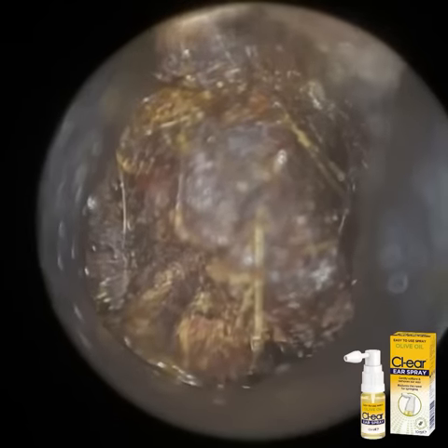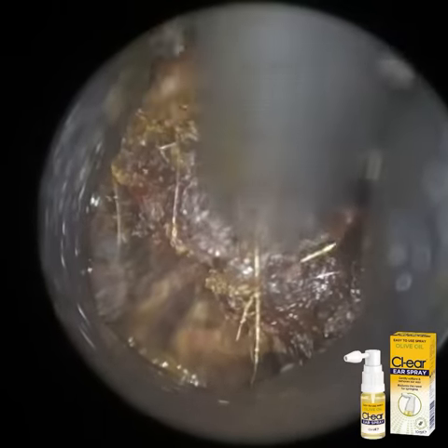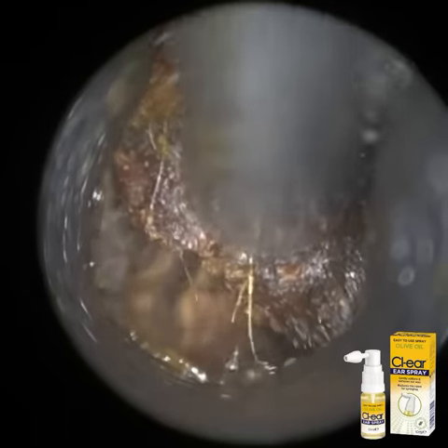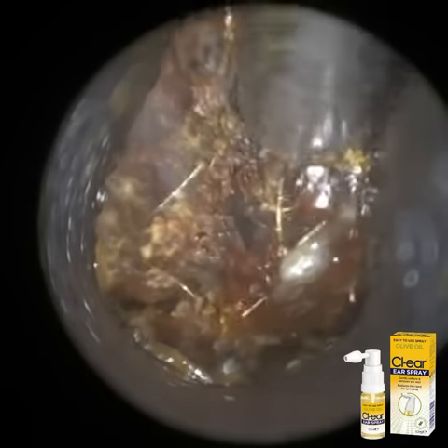So you can see this wax plug has been there for a while. It's really dark. I've just adjusted the focus again. And probably got a third of the wax out already. And this is the large lump. You can see I'm using those little wriggle movements with the sucker just to slowly extract this out of the ear.